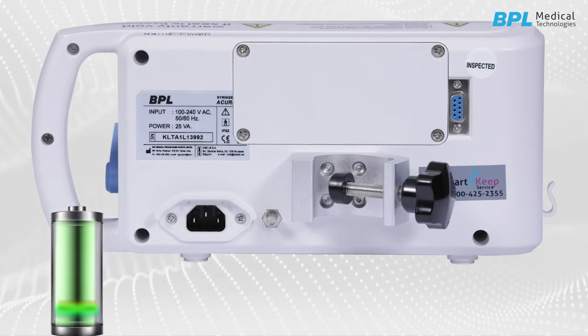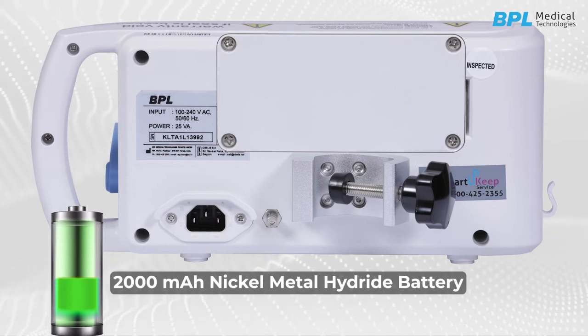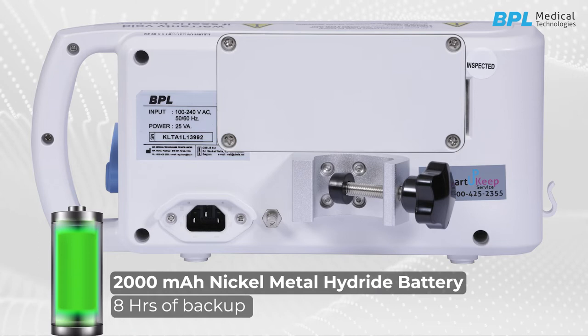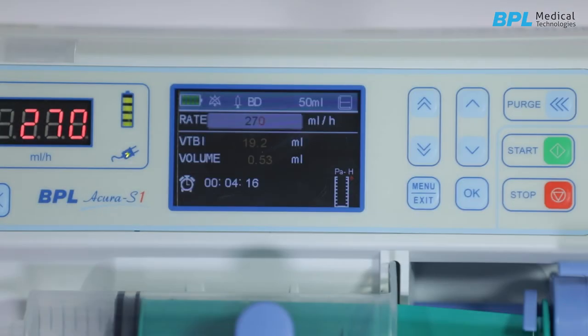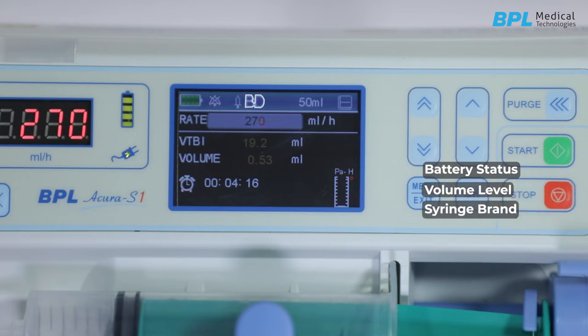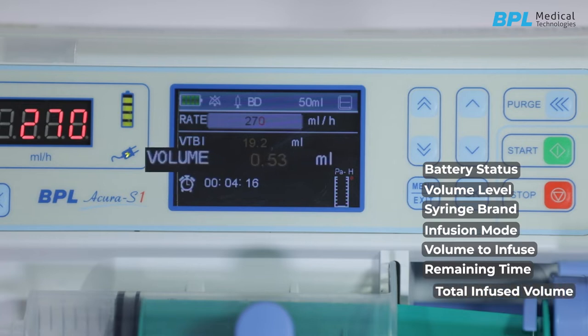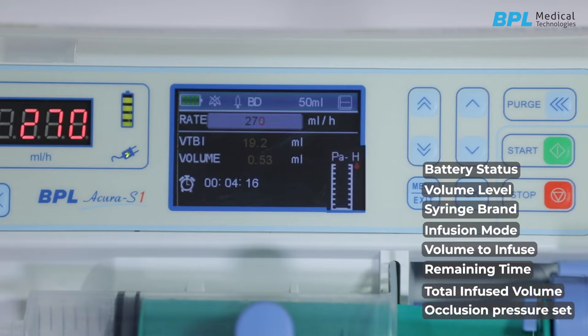The device has a 2000 mAh nickel metal hydride battery which gives eight hours of backup. As you can see, the screen shows the battery status, volume level, syringe brand, infusion mode, volume to be infused, remaining infusion time, total infused volume, and occlusion pressure set.